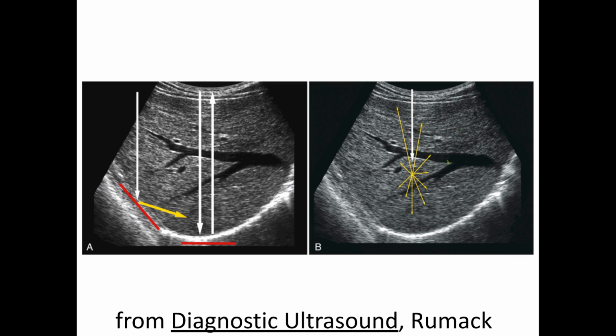Here in the middle, you get this nice big blood vessel. This is probably part of the portal vascular system, and what we can see is, again, where you go from blood to vessel wall. It's this nice bright signal when you're perpendicular to it. Out here towards the periphery, it's probably bouncing off more obliquely and you're not seeing that bright wall. And then within the vessel, it's filled with blood, so it's going to be anechoic.